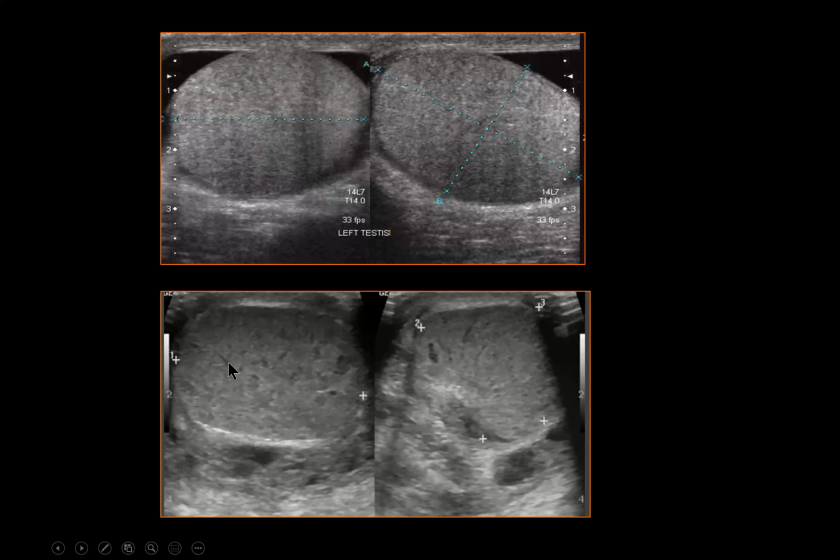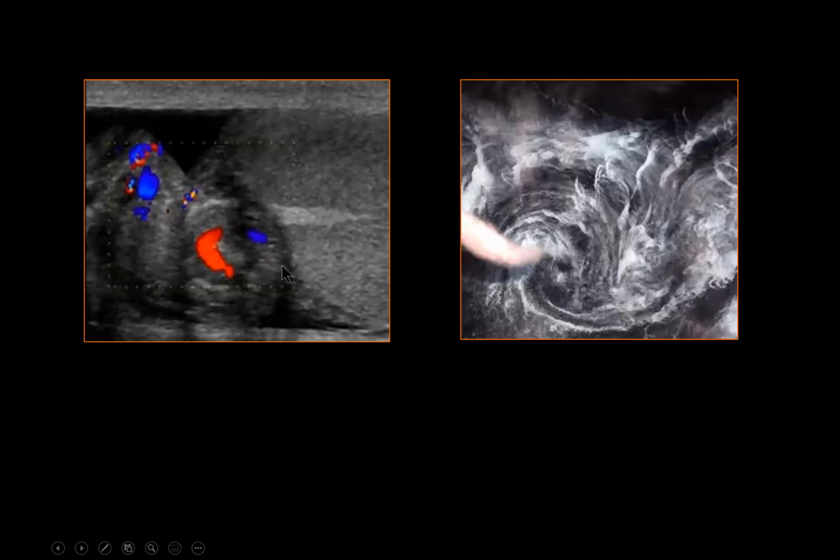And this is a twisted spermatic cord. It is rarely seen twisted, but with the help of the fluid around it, the twisted spermatic cord is enlarged, at the area superior and posterior to the epididymal head, and you will see an echoic structure representing veins, resembling what is called the whirlpool sign. It will give you a whirlpool sign. This sign was also detected by MRI.